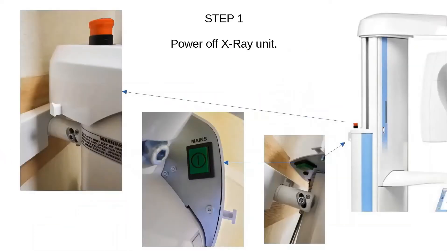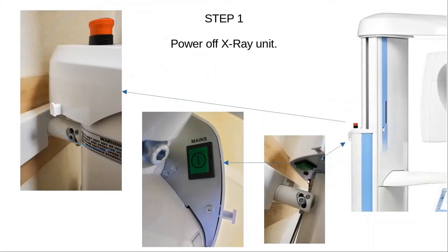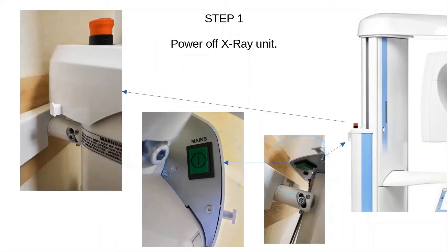To power off your X-ray unit, you need to locate the emergency button on your X-ray unit. Underneath it, you will find a power cutoff switch labeled 'mains.' Press and release that button to cut off power to the machine — that is how you power off your X-ray unit.